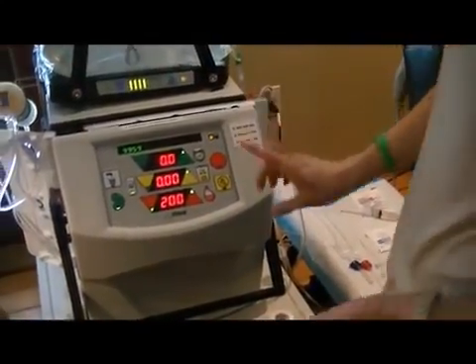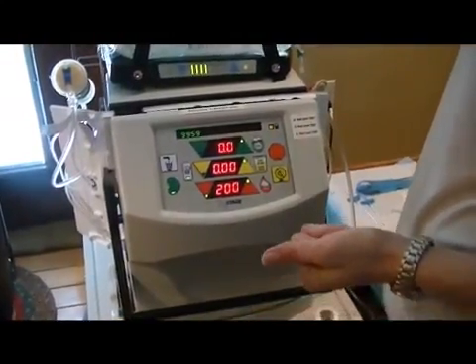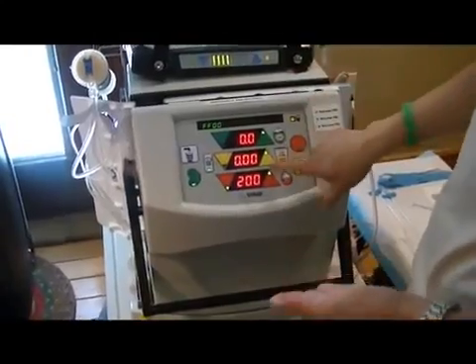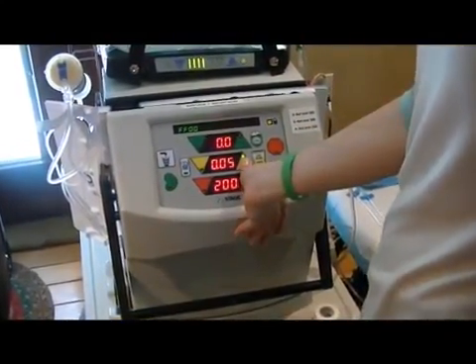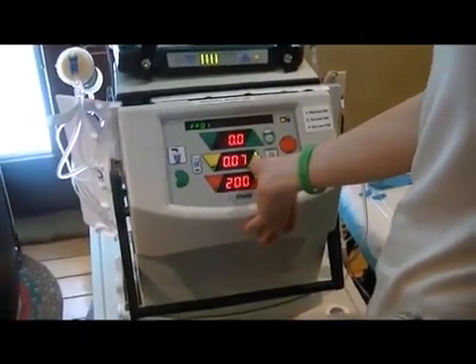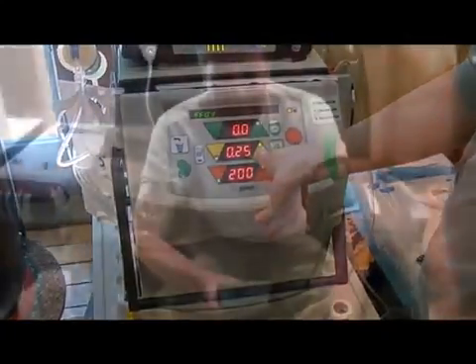And we can set the machine now too. We've figured how much. You always add 0.3 because that's how much he gets in the rinse back. So we'll set the machine here. This is the volume screen and a rate screen, and you set it to what you want it to be.